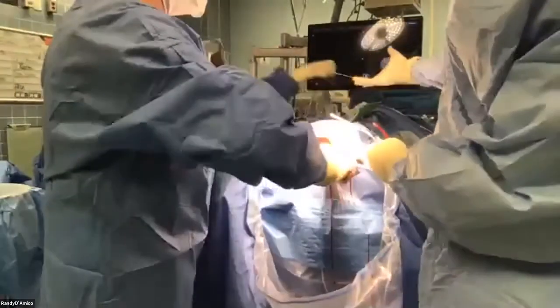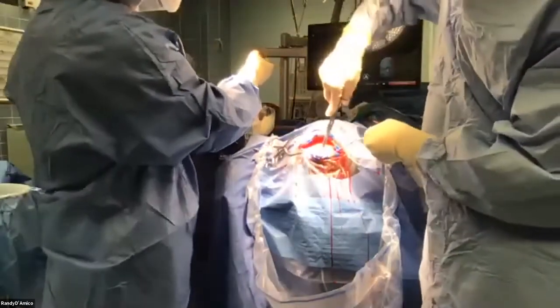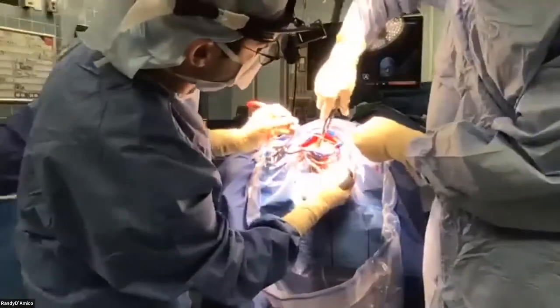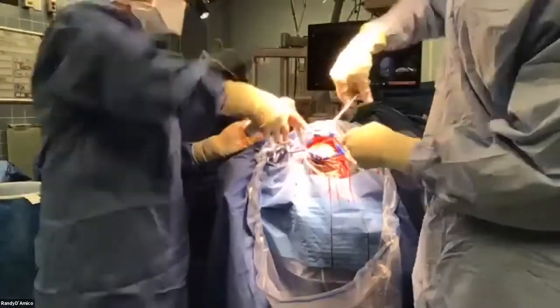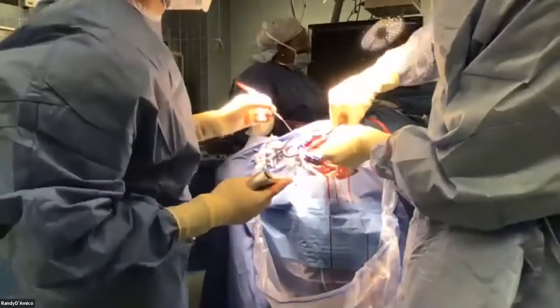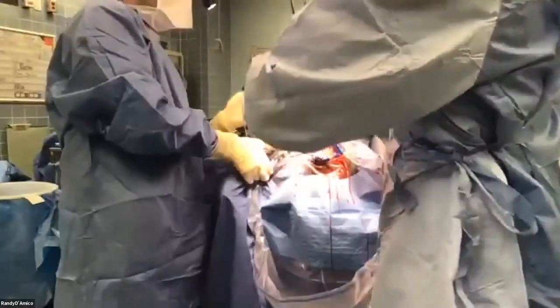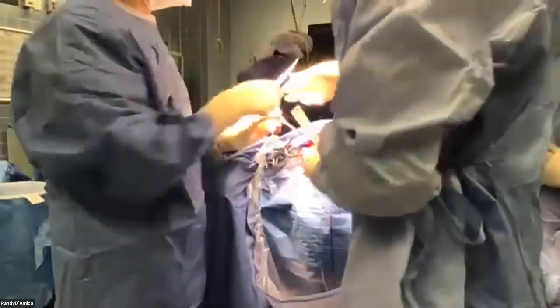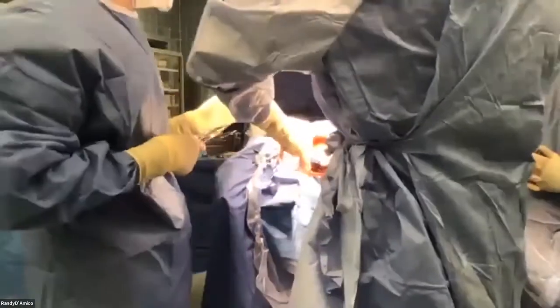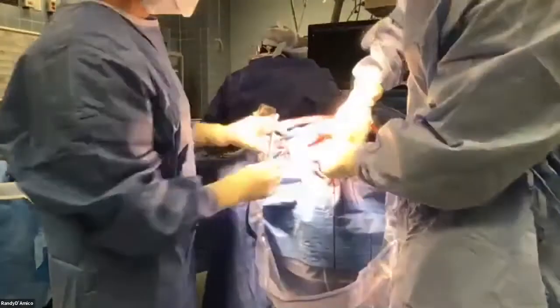So the way to do that basically is you have scalp, you've got a layer of fat, and then you've got galea, which is the tensile layer of the scalp, and then pericranium is on the bone itself. And so what you want to do is separate the scalp from the pericranium, and that'll give us some room. Also help us mobilize everything. Come this way, okay? And use your finger to really separate. I think it's going to be a big defect. I think finger is going to be the safest, most blunt instrument.